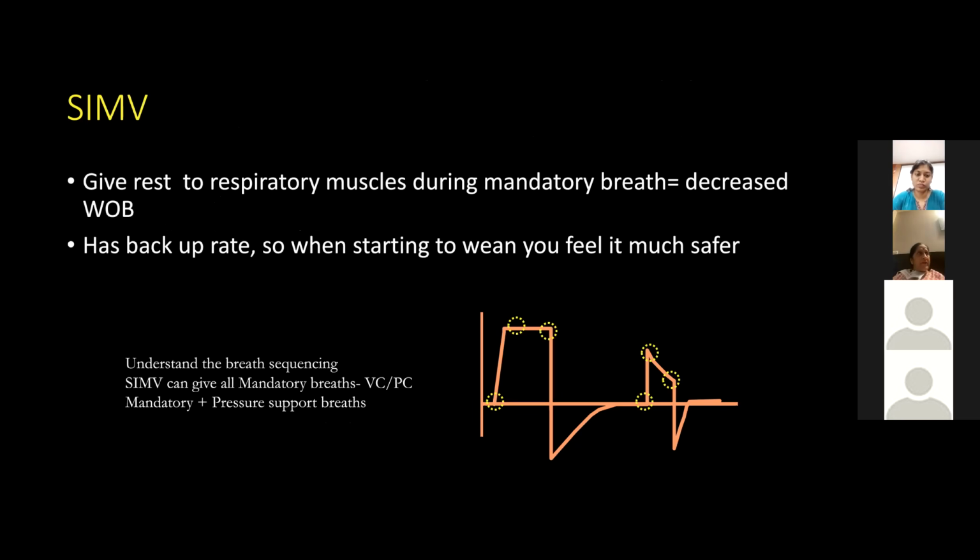Now, the last 3 slides, SIMV. You are all good friends with it, no? You all think that in SIMV, during mandatory breaths, the patient gets rested and the work of breathing decreases. Is this your understanding, yes or no? Dr. Nisha, is that your understanding? Yes, sir. Dr. Anbumani, is that your understanding? Yes, sir. It might decrease the work of breathing. But actually, it is not like that.